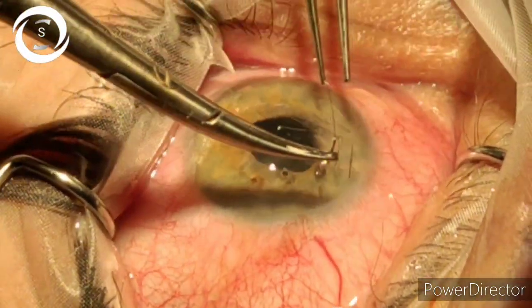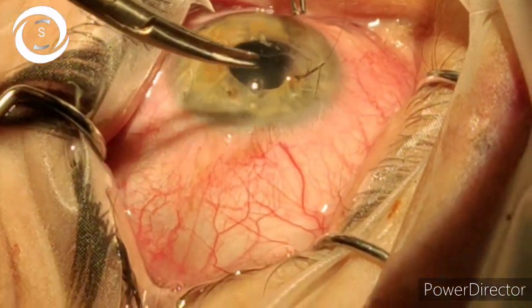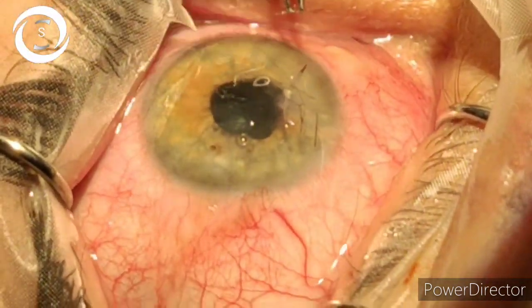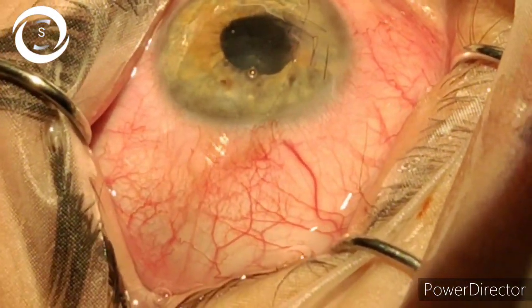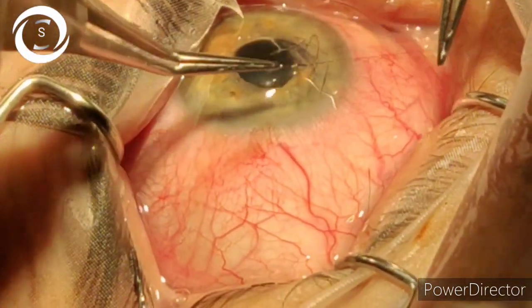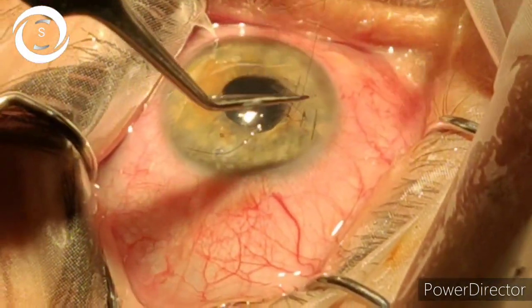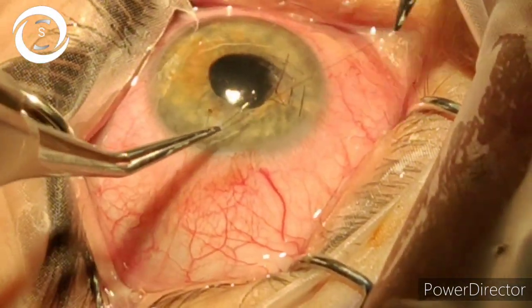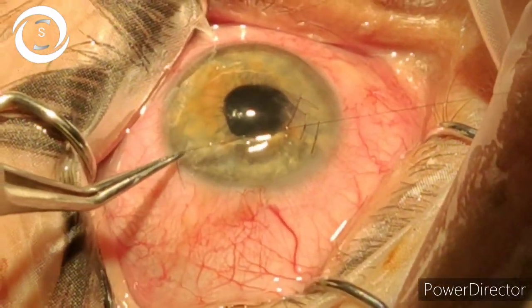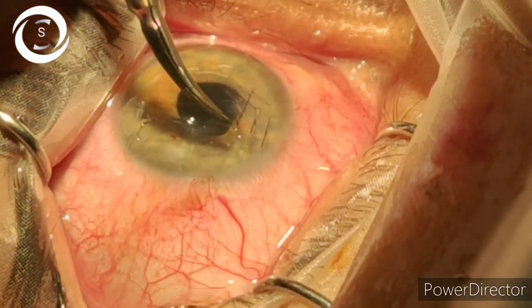The last suture was a very challenging one — it was the longest horizontal suture, and in this I incorporated the two vertical sutures as well. I made sure to come outside of the medial vertical suture so both vertical sutures are incorporated in the last horizontal suture in such a manner that it is not causing any distortion or pull on those sutures. You should learn this technique of how to incorporate already-placed sutures into the next one in order to stabilize the wound.